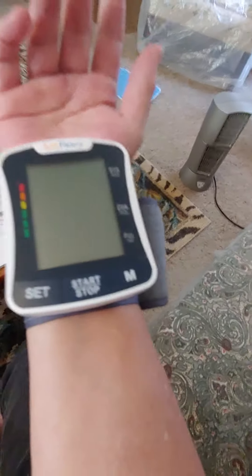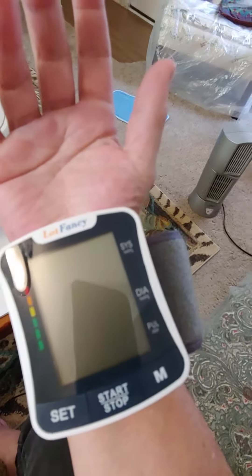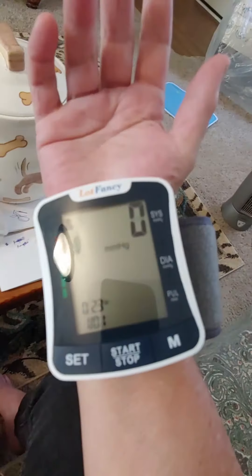I'm going to show you how to work this thing without trying to mess this up. Watch — you push start and stop. I just pushed start.